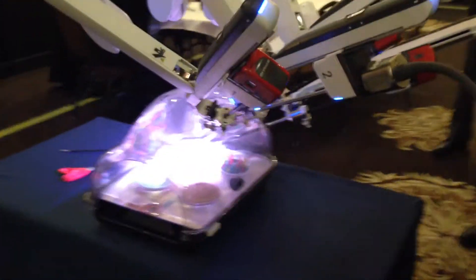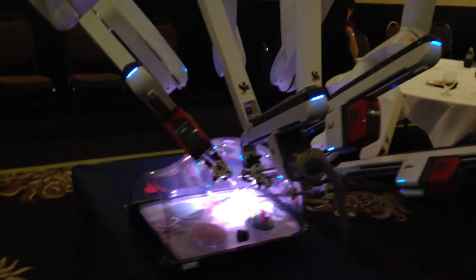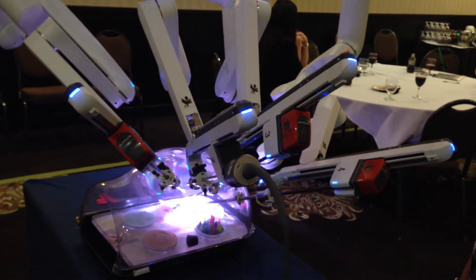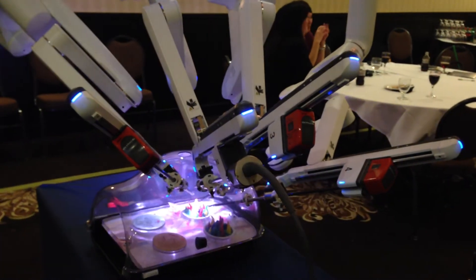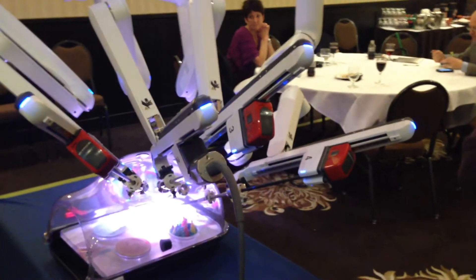One more thing — you can actually push this to be the 30-degree scope from the surgeon console. When you go to take a photo, you can do it from the surgeon console as well.